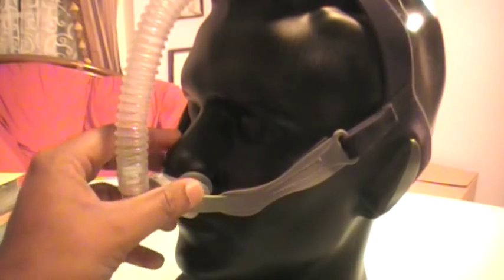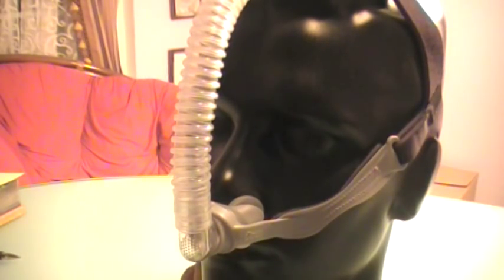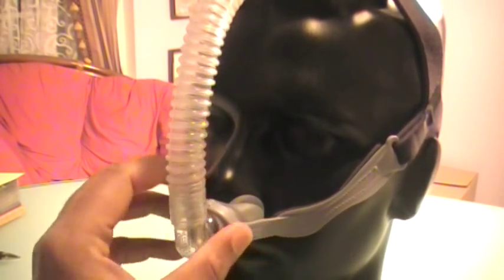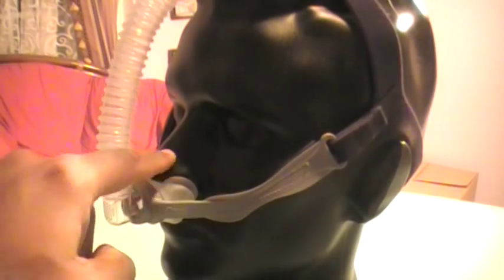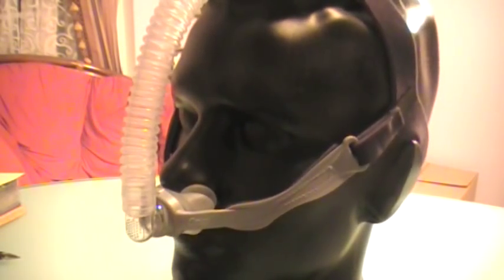This is truly extremely lightweight. Because the footprint is so small — look how small it is — it really doesn't bother too much around your face as far as bruising is concerned.